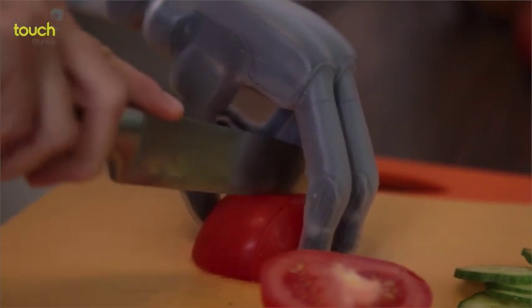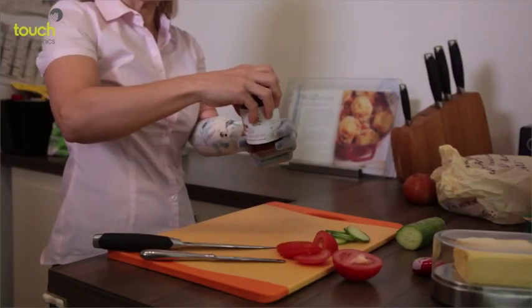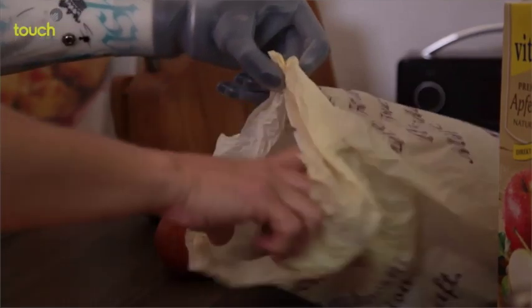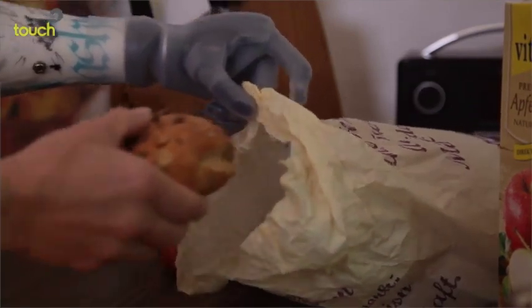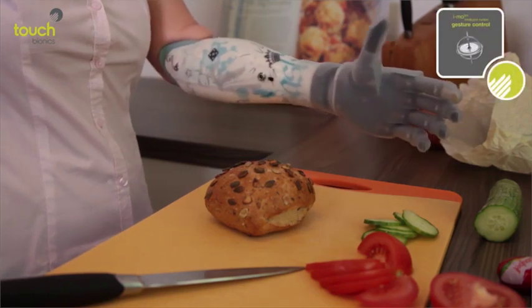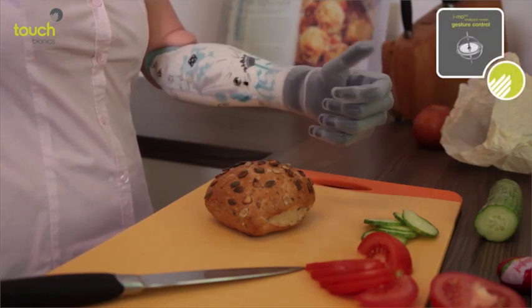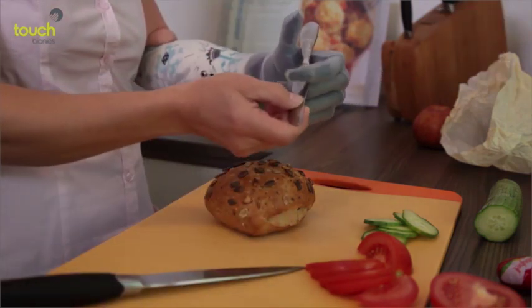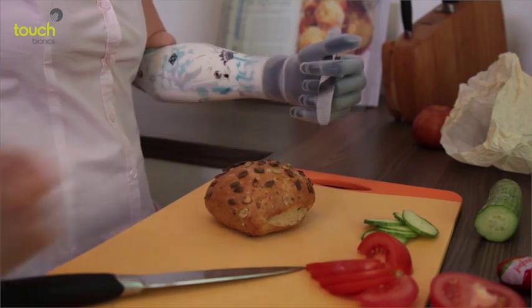The other thing you'll notice are the tomatoes. You have to be a little more delicate with that, otherwise you're going to have ketchup all over the place or tomato sauce squished around. So she has the ability to control how much force she applies to something. Here's another grip, really ideal for utensils. So she's going to use it for a knife. There we go.